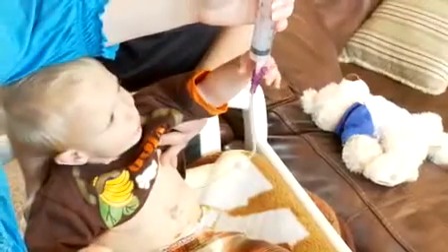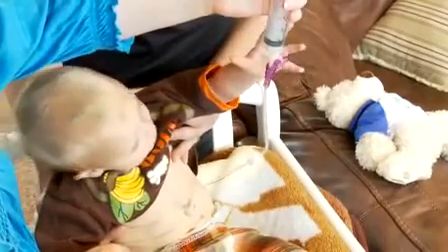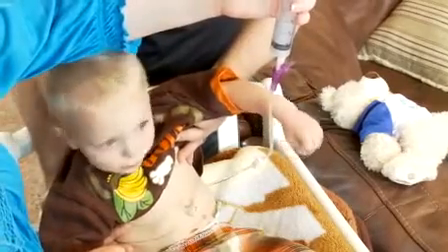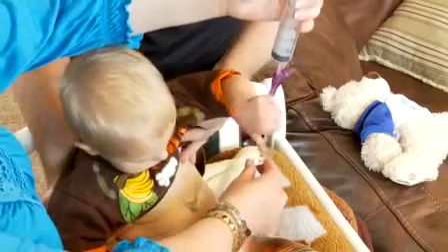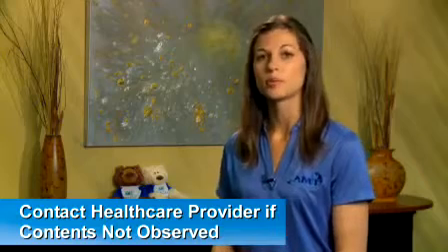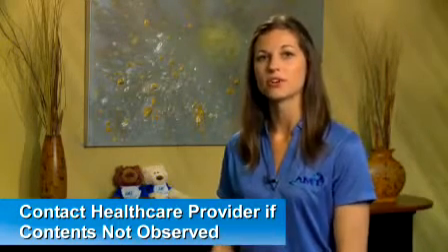Some healthcare providers recommend that you ensure the button is in the stomach by checking for stomach contents. To do this, connect a feeding set to the button and using the large syringe, gently draw back until stomach contents can be seen in the feeding set. You may hear a release of gas from the stomach into the feeding set when it is inserted. Once you have observed the stomach contents, make sure to return them back to the gut. If contents or gas are not observed, call your healthcare provider. Do not feed into the device until proper placement is confirmed.